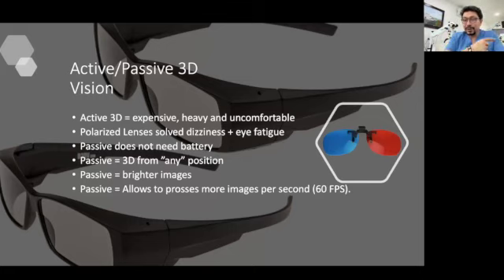The 3D vision in the Promise Vision is a negative 3D vision. You are seeing that the depth of vision is going inside of the screen. And that's quite important. If you compare different brands of microscopes, the first thing that you need to see is if you have negative 3D vision. If the microscope has positive 3D vision, it is bad.